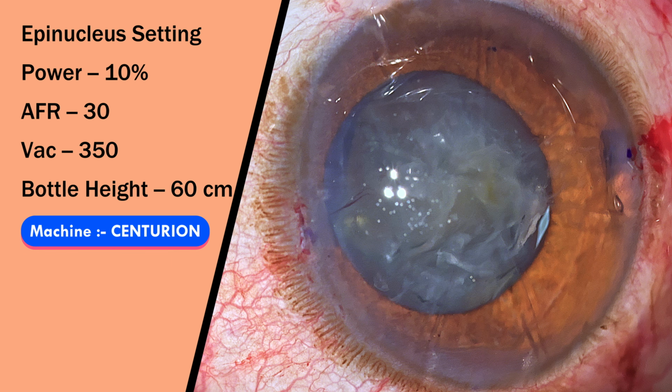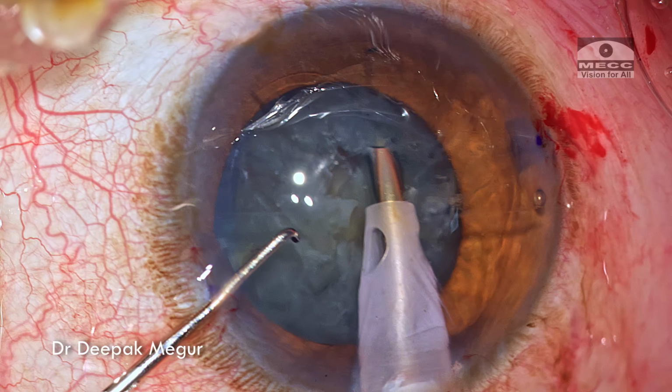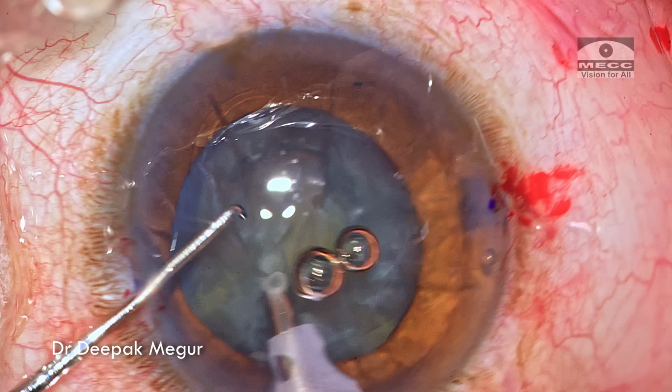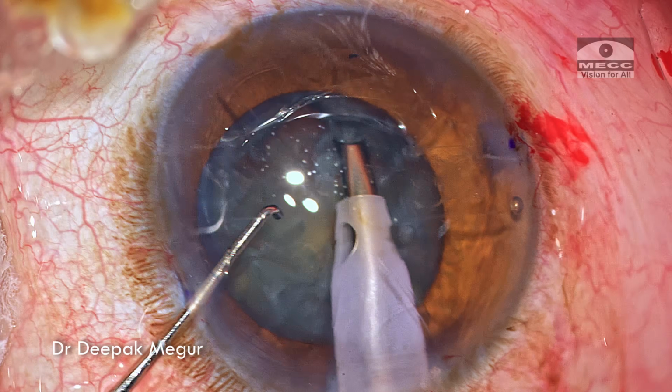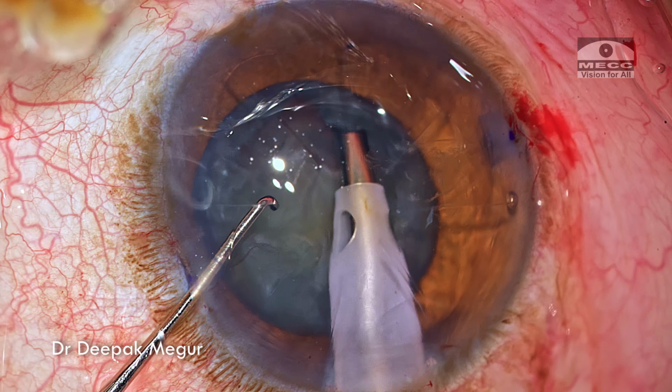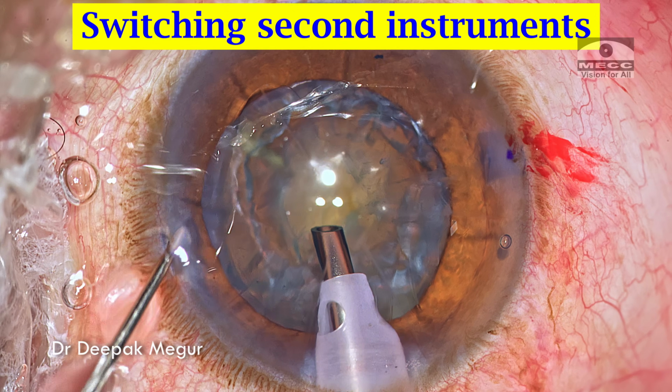So the only thing which I'm going to do is bring down the bottle height to about 50 to 60 centimeters from the usual 90 centimeters which I'll be operating. And to compensate for that, I also will be reducing the flow rate and the vacuum to ensure that the chamber is maintained well. And this philosophy is going to be utilized in all steps of phacoemulsification. The superficial epinucleus and the cortex is being aspirated out, followed by beginning the trench. I plan to do a stop and chop technique in this case.